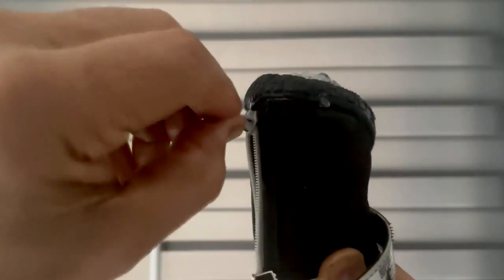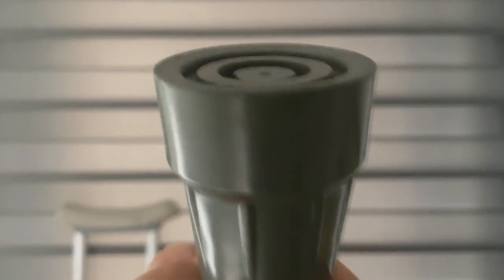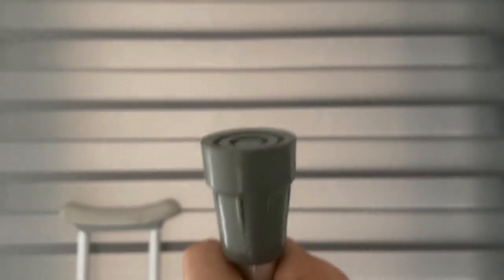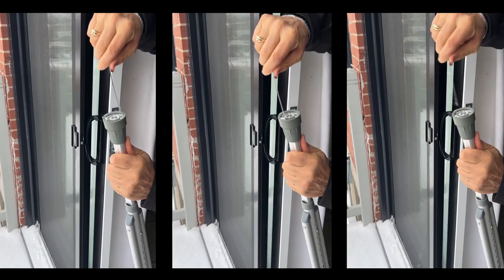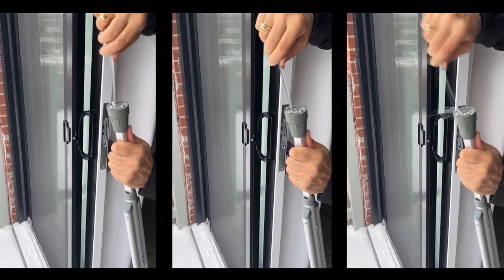When you remove the boots, your crutch tips remain dry, ensuring a secure grip on any indoor surface. Lastly, these boots are a tremendous time-saver — gone are the days of laboriously cleaning your crutch tips after outdoor use.